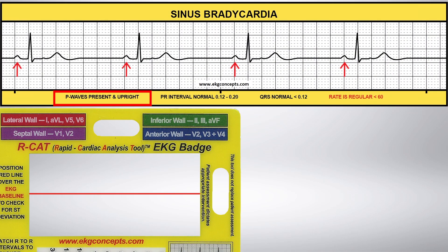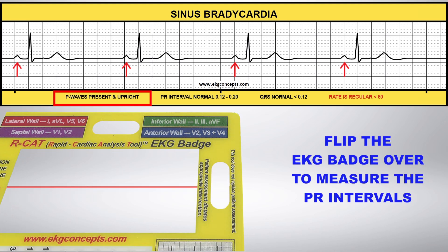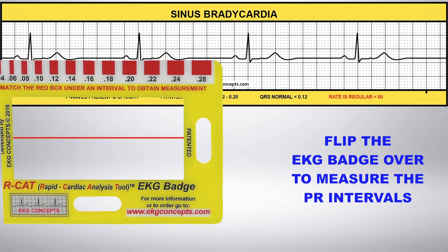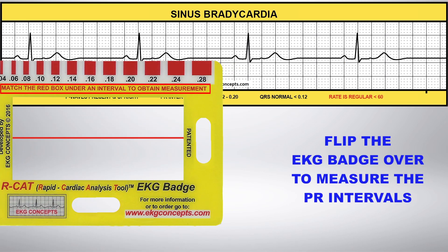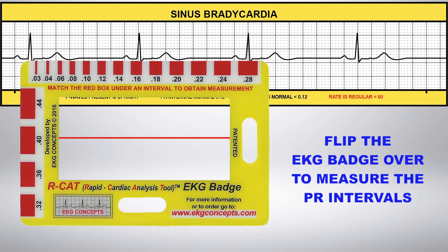Notice that all of the P waves are present and upright. Now flip the badge over to measure the PR intervals using the calibrated red boxes. The PR interval is consistently .20, within the normal range of .12 to .20.